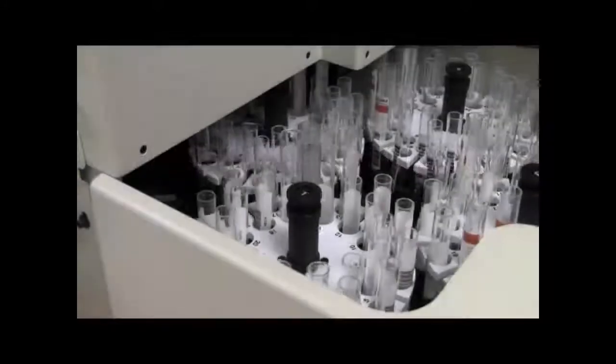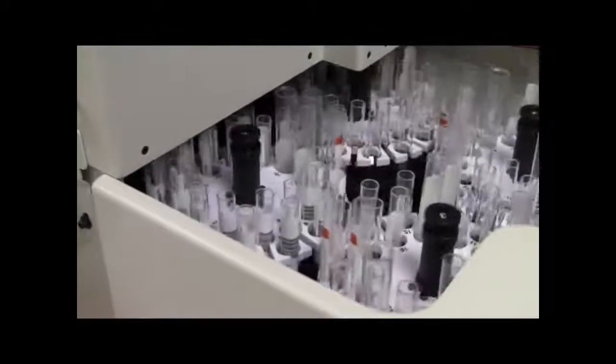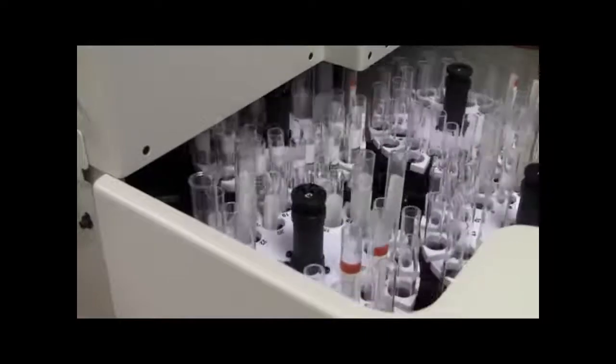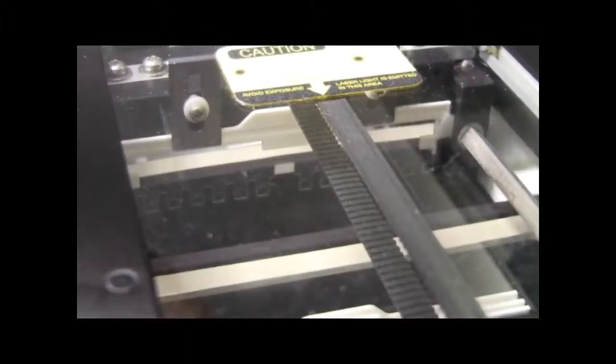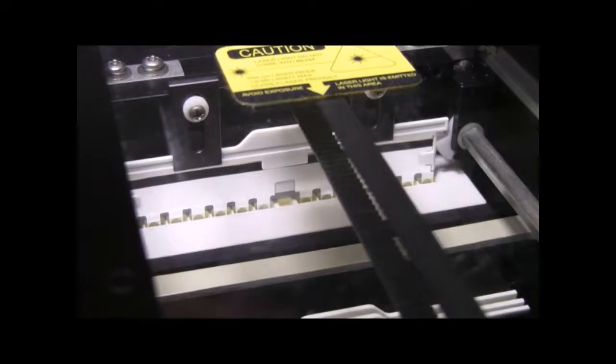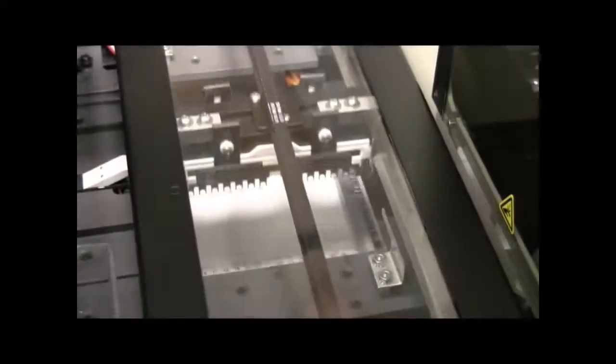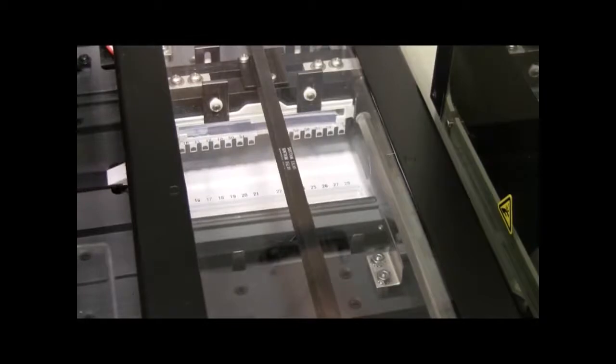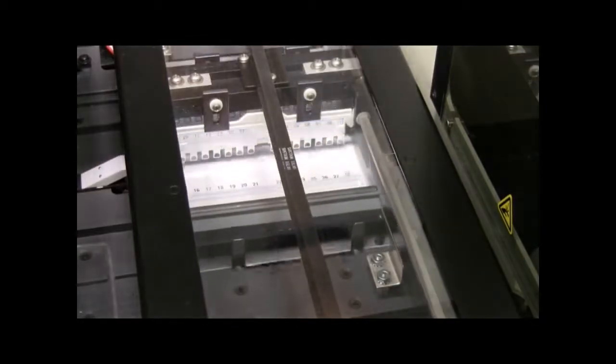This video shows every major step for doing immunofix. The Spiffy 4000 reads patients' barcodes for positive patient identification and then samples the correct sample, making proper dilutions and loading the sample into the sample well tray. Afterwards, the applicators automatically pick the sample up and transfer the sample over to the agarose gel.